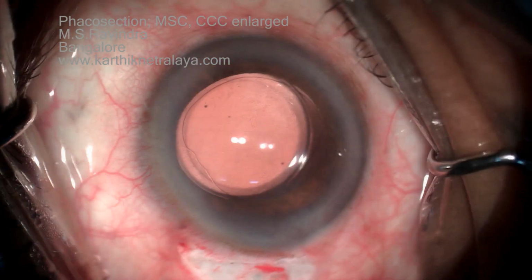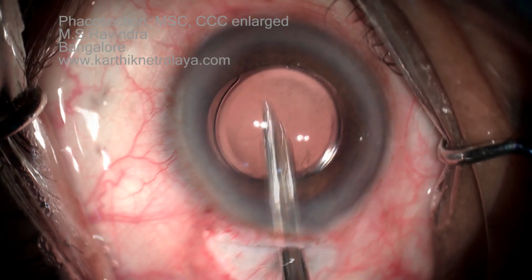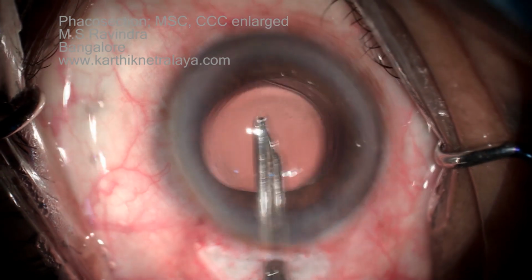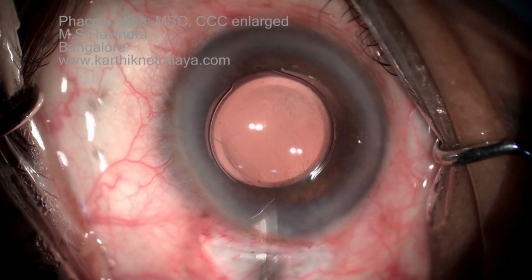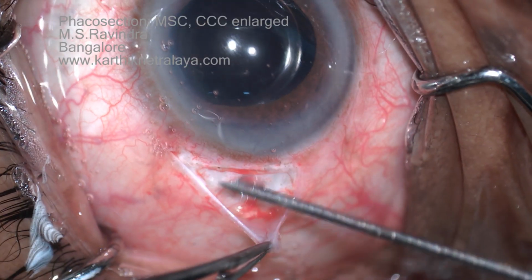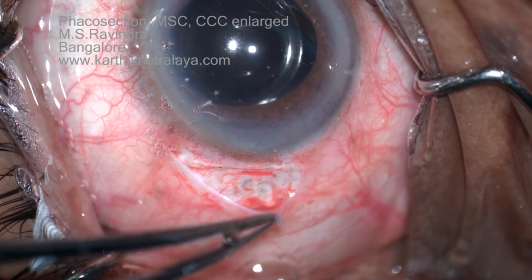Complete visco aspiration is essential from the capsular bag, from under the lens, from the angle region, and from what is stuck on the back of the endothelium. That's where I form the chamber at the end. There's no need to hydrate the tunnel.